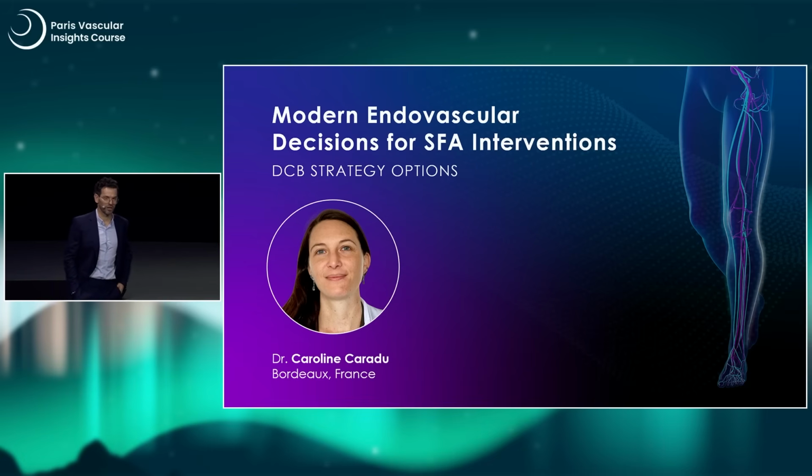I was not very confident with this option, and I really didn't want to implant a stent here because it's a severe patient with an AAA graft, another graft on the other side. So it perhaps comes later, he is only 70, but I wanted to keep options.